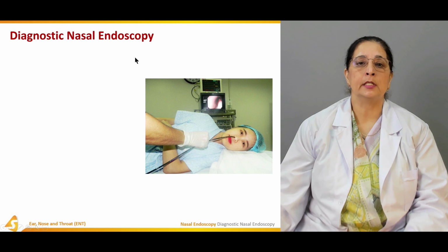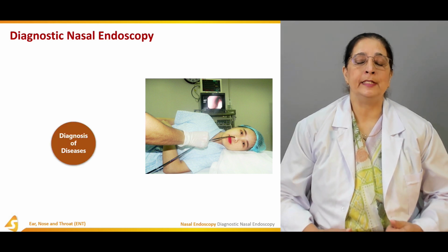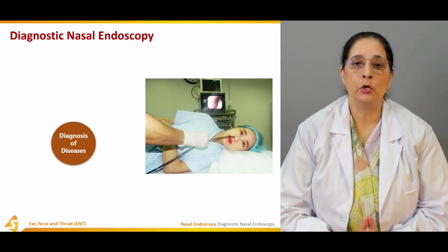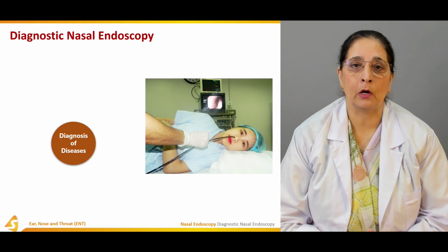So diagnostic nasal endoscopy is for diagnosis of diseases. What diseases are diagnosed by performing nasal endoscopy?